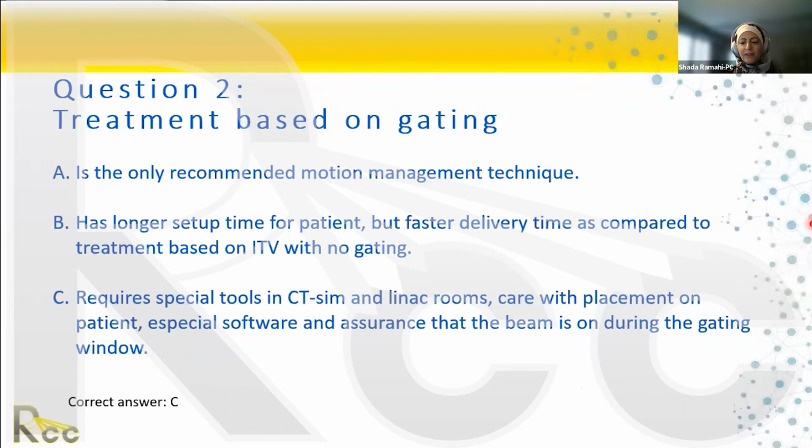So you have to take note where this block is placed on the patient, and we'll cover that tomorrow as well. Whenever you put the block or the bellows belt, you have to document where on the patient it was put.